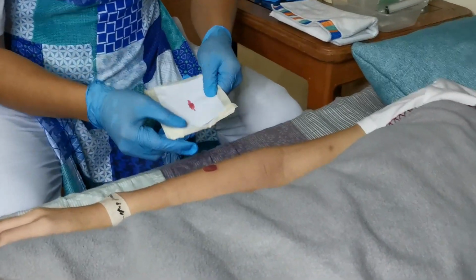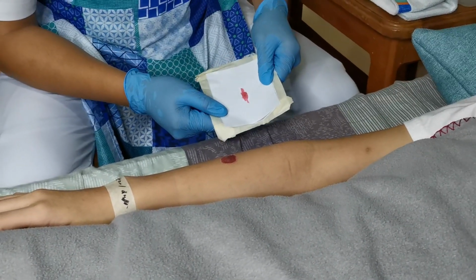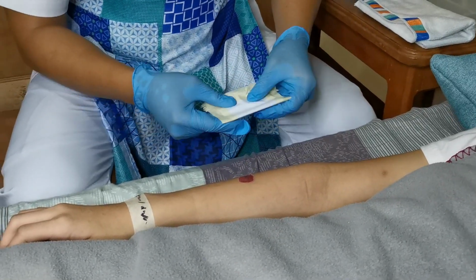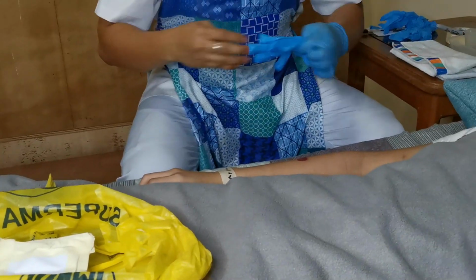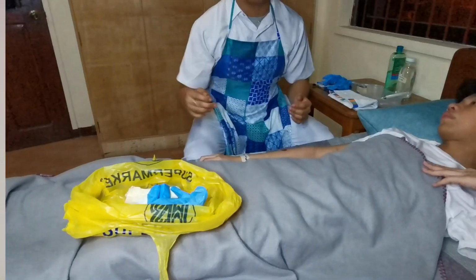After that, you have to assess the dressing. So we have here slight bleeding from the wound, and then you have to dispose the old dressing properly into the biohazard bag and remove your old gloves to prevent contamination.